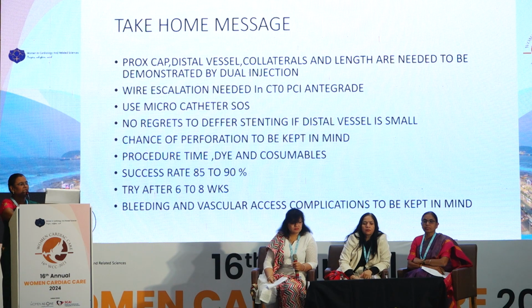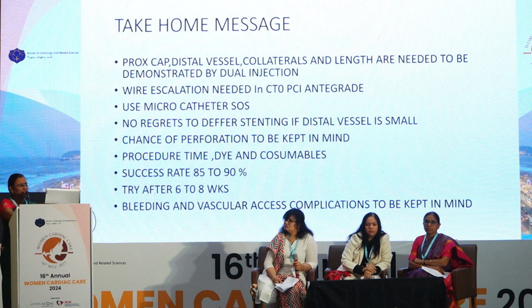Wire escalation is needed in CTO PCI antegrade. Use a microcatheter if needed. No regrets to defer stenting if the distal vessel is small. The chance of perforation is to be kept in mind every time, as well as procedure time, dye and consumable usage. The exhaustion of resources has to be kept in mind. In advanced centers, the success rate is around 85 to 90%.